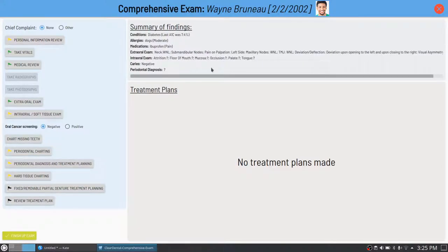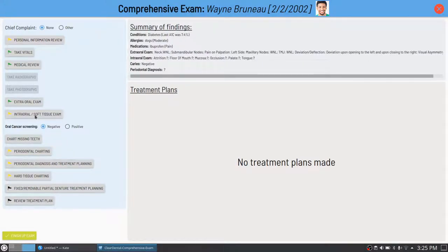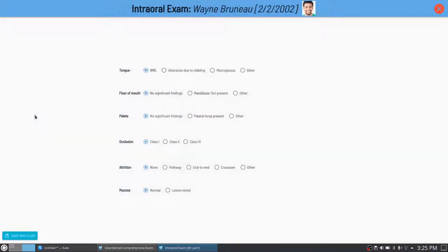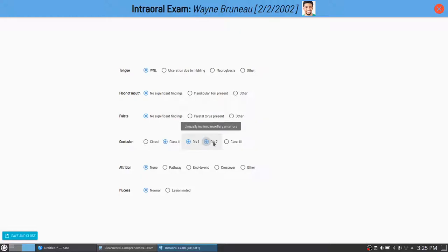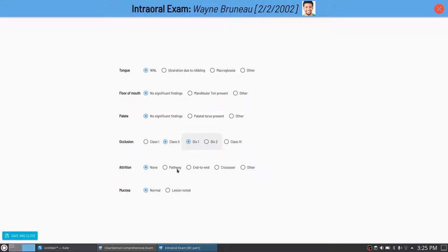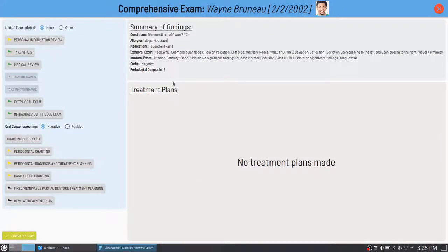This is all scrollable. The intraoral exam is a very similar idea — you have findings for the tongue, mouth, and other structures. For Class 2 occlusion, you can specify Division 1 or Division 2, and it gives you a quick reminder of the difference. You can also record what kind of attrition the patient has. After saving and closing, it updates the summary again for intraoral exam.